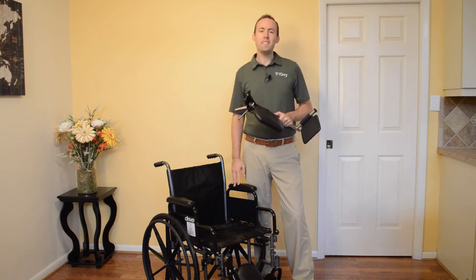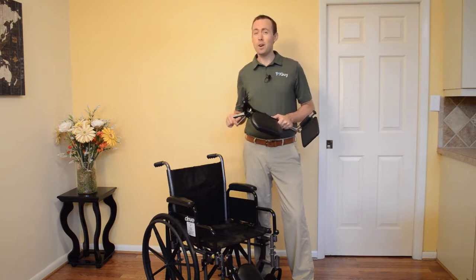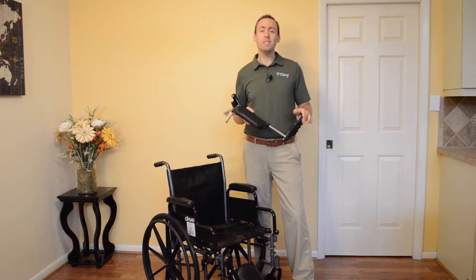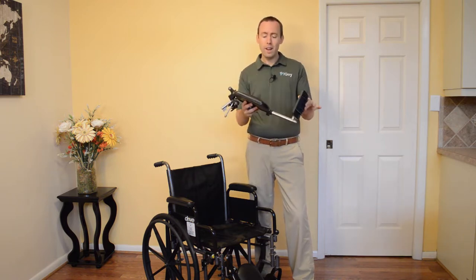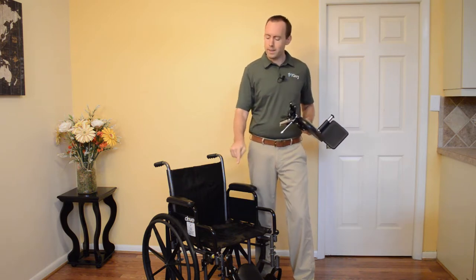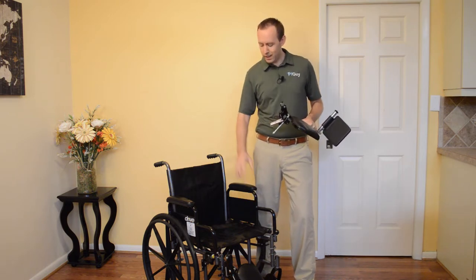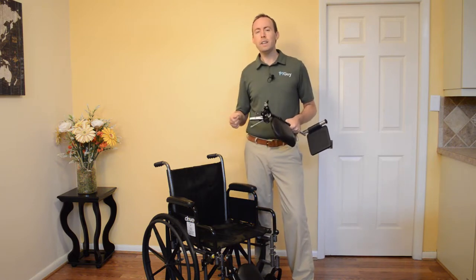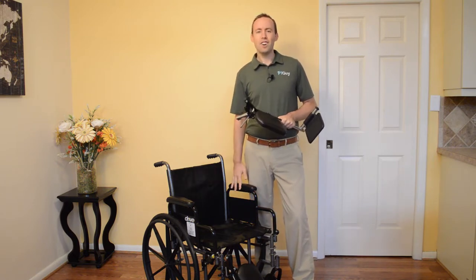Greetings, this is Sean your PT guy here. Our videos help you move better and stay independent so you can enjoy your life. In this video, we're going to show you some wheelchair basics that everyone with a wheelchair needs to know about. We'll go over the leg rests, how to adjust them, what to look for, the brakes and how to manage those brakes, the arm rest, and finally how to fold up that wheelchair if you need to put it away. Let's get started.